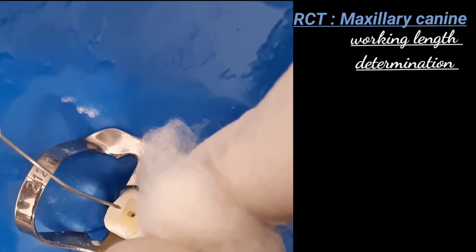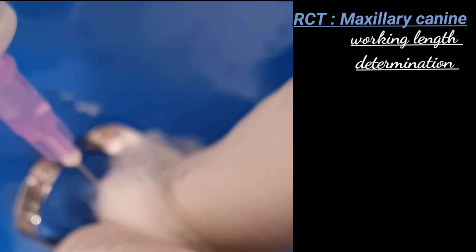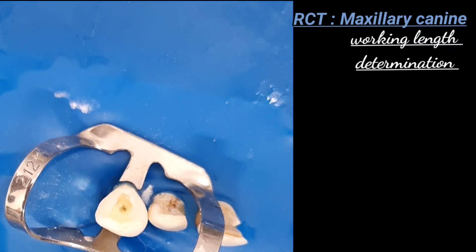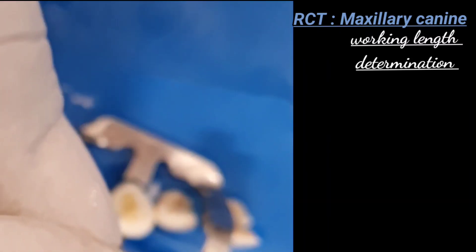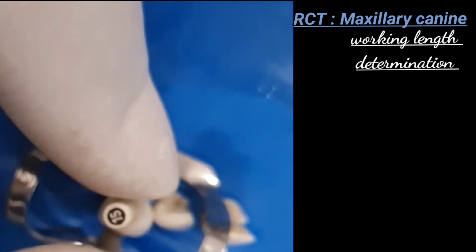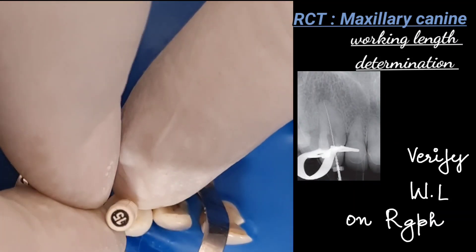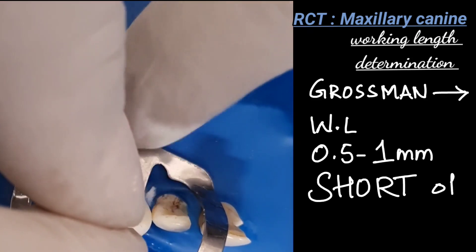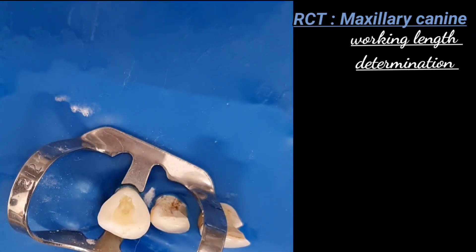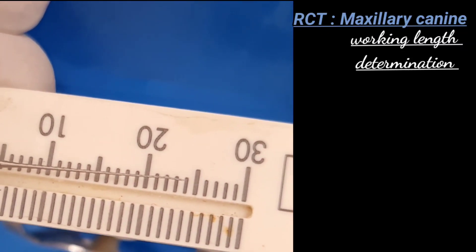These fine flexible files fit into tortuous canals and are stiff enough to be inserted through debris and tissues to reach the root apex. The K-file is inserted with a slight reaming motion to bypass any obstruction and estimate the working length. The instrument is then removed and examined for curvature, and any anatomic variation is recorded. Copious irrigation with sodium hypochlorite and saline is done alternately after each file. Always verify the exact working length on a radiograph. According to Grossman, working length is kept 0.5 to 1 millimeter short of the radiographic apex. For curved canals, you can pre-curve the file by bending it with a gauze.